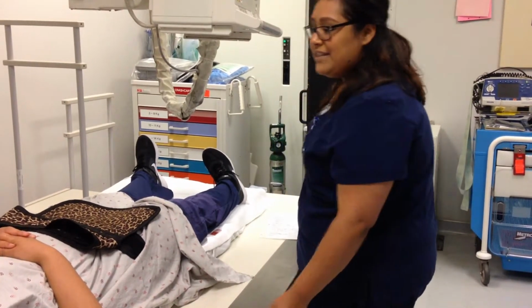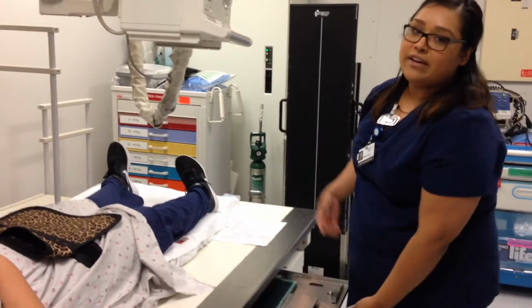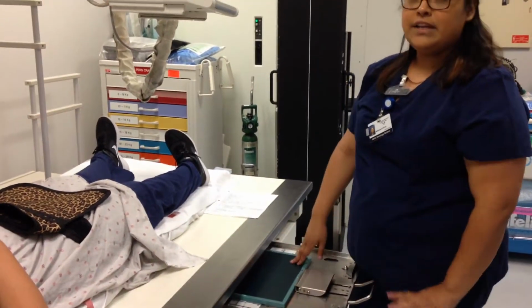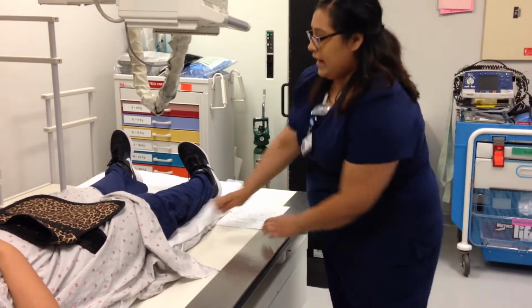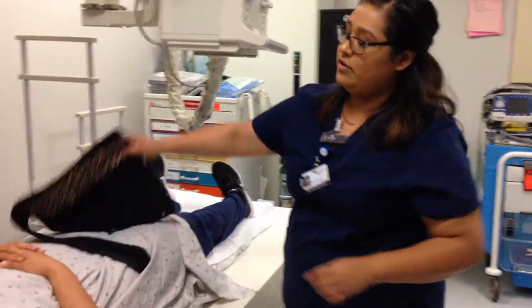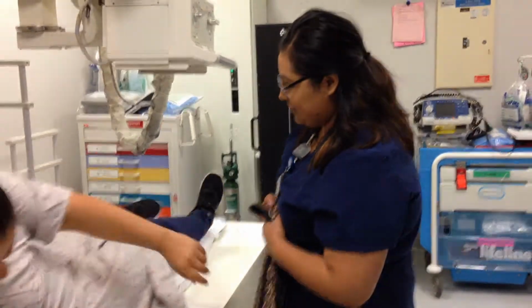That's good. Okay, hold on still, okay? The X-ray. Okay, well, I'm switching out our cassettes as always and reading this and then putting in a clean one. And for the next image, I will be doing a lateral knee. So Miss Garcia, I'm just going to ask you to turn to your right side, okay?